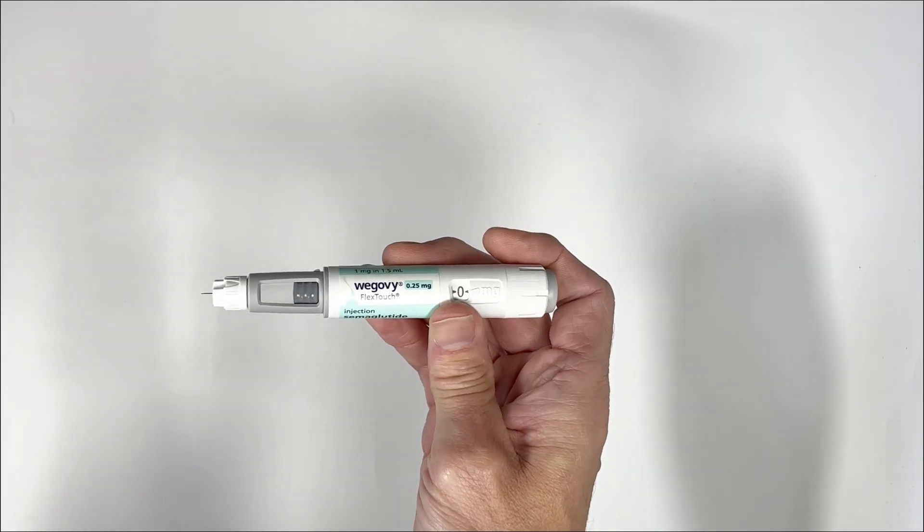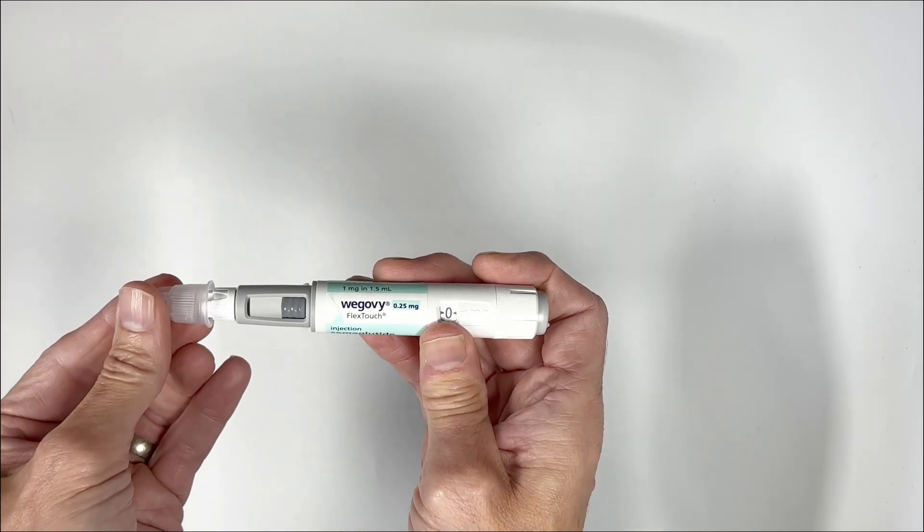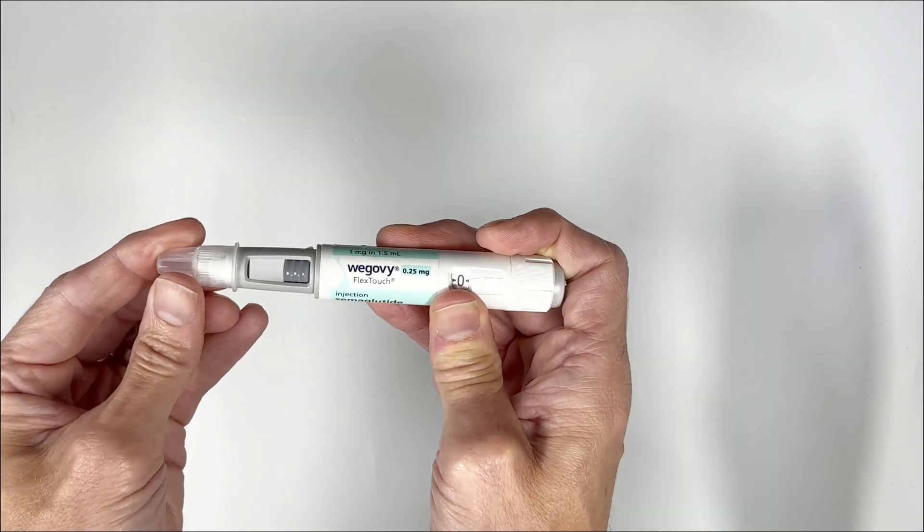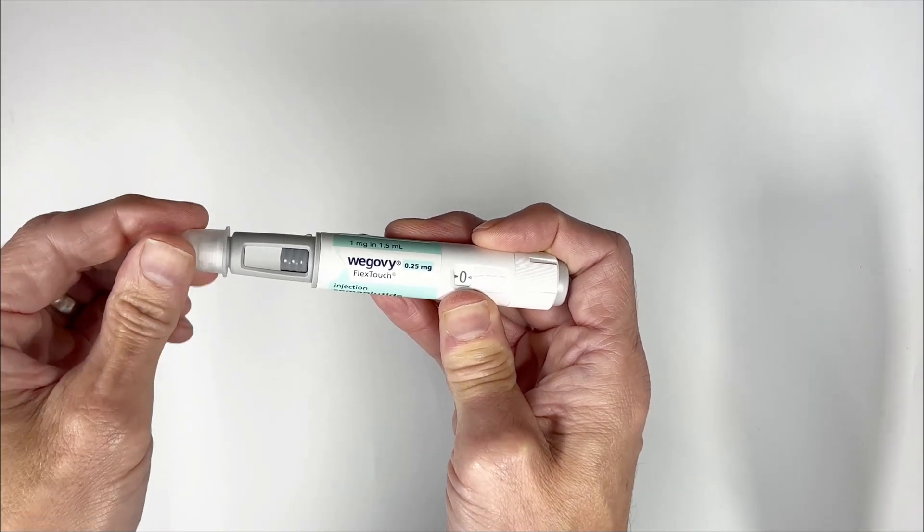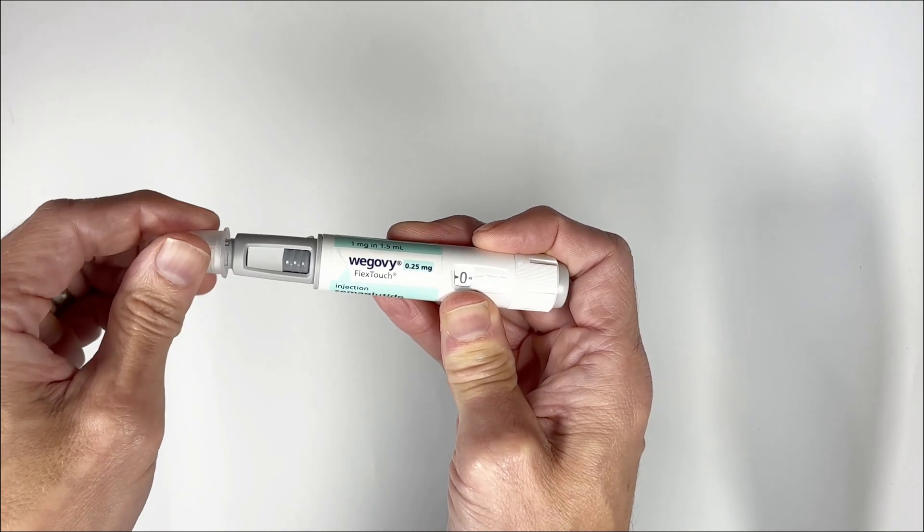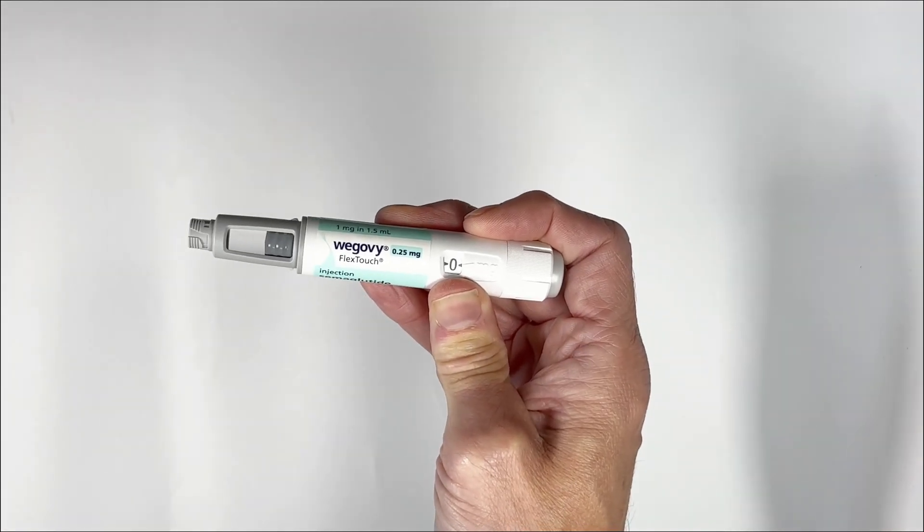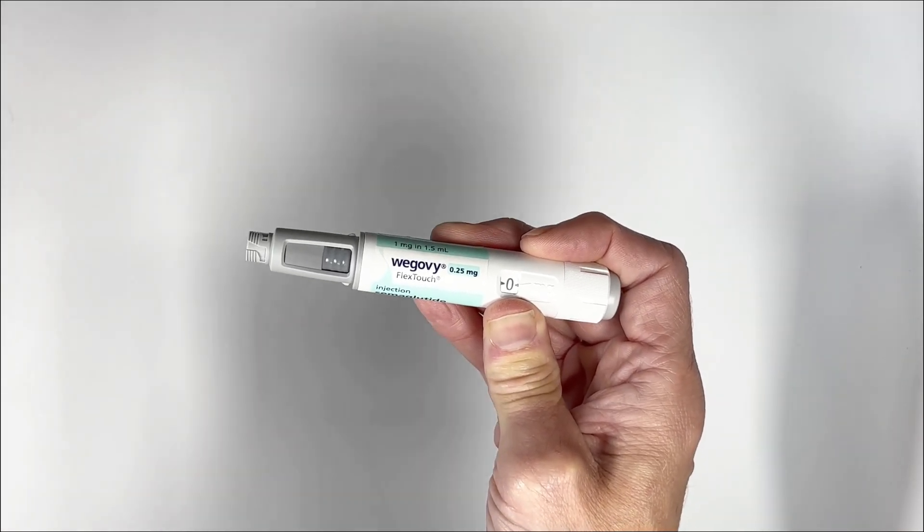Always remove the needle after use. Place the outer needle cap on firmly and unscrew the needle. Put the pen cap back on the pen for the next dose.